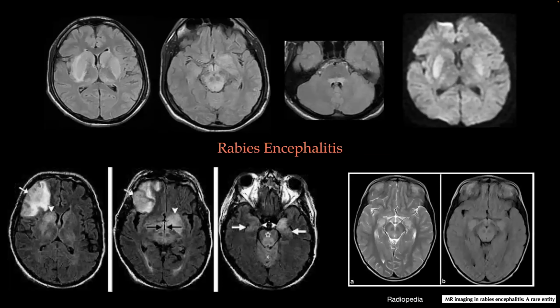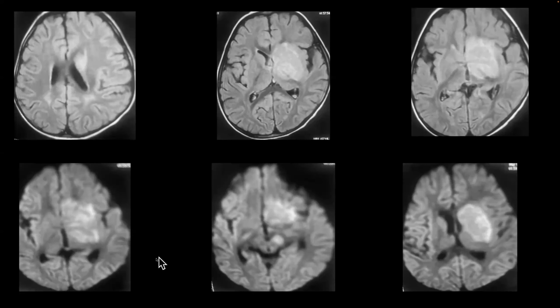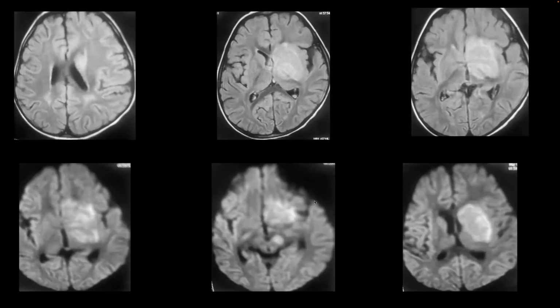So I don't know, was the dorsal brainstem involved at all in this case? Not the dorsal, the ventral is. Peduncle is involved. At least these are the images. Dr. Vivek, any idea for dorsal brainstem? Doesn't look like it. Sorry? Midbrain. The dorsal brainstem, was it involved by any chance? Because these are the only images. No, it was not.